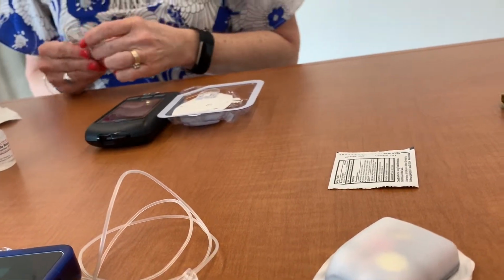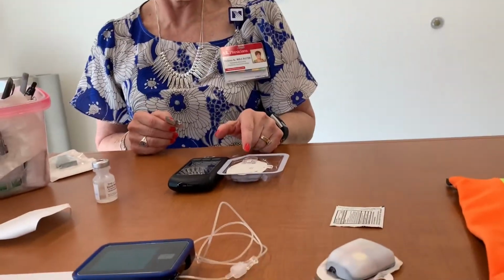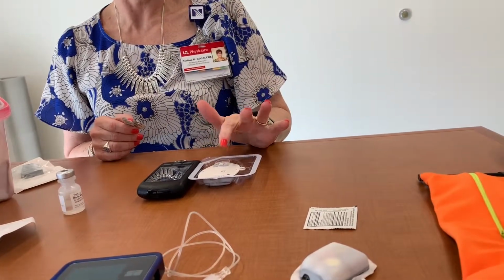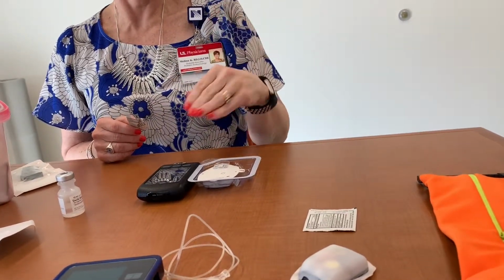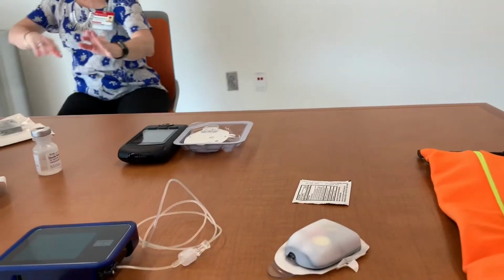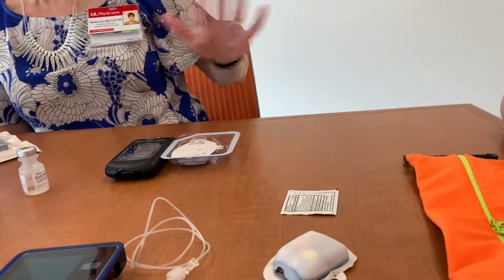Do you get rid of the pod, or do you keep using this? You use a new one every 2 or 3 days. So they can go into the trash. They can, or Omnipod has a recycling program. They'll send you an envelope, you put 50 pods in and send them back. There's little watch batteries and things in it, so they take those batteries out and recycle those, and they take all the plastic and shave it down and remelt it and reuse it. A lot of people don't want to put those watch batteries in the landfill. Right. But if you need to, you can just throw it away.